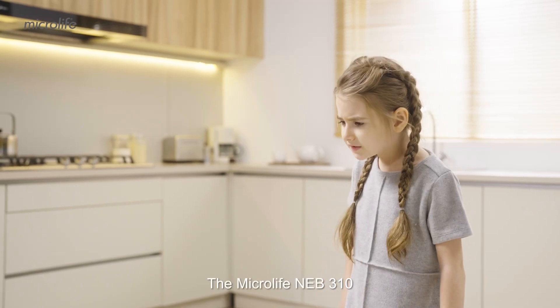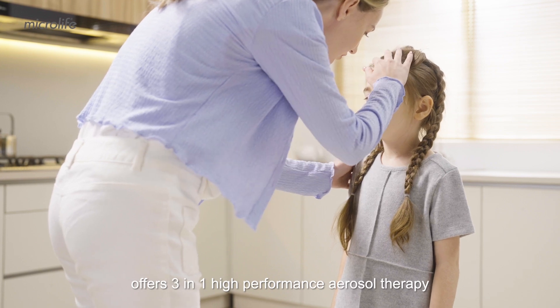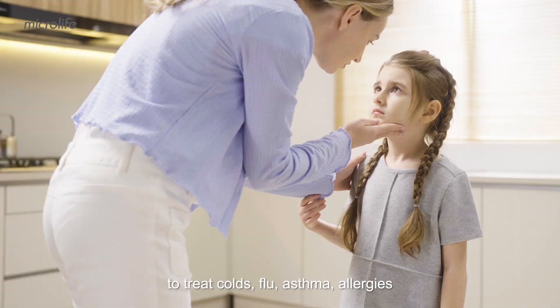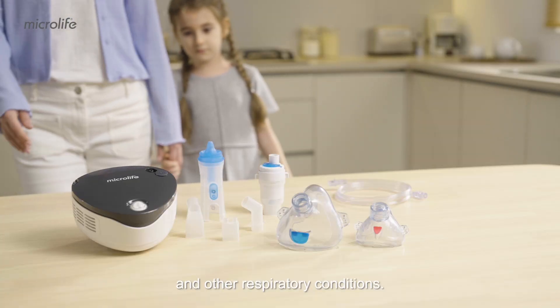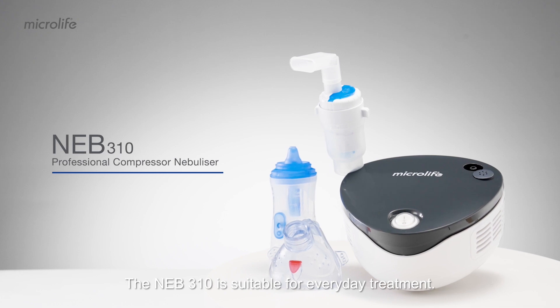The Microlife NEB310 offers three-in-one high-performance aerosol therapy to treat colds, flu, asthma, allergies, and other respiratory conditions. The NEB310 is suitable for everyday treatment.